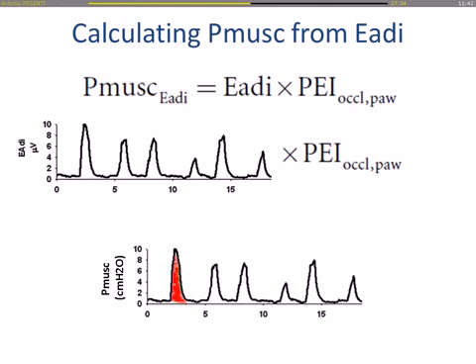The transpulmonary pressure will be minus 40 if he has 10 of PEEP. But most of all, his muscles are working to generate minus 30 centimeters of water. This simply by measuring the electromyography of the diaphragm and doing an inspiratory occlusion to calibrate it.